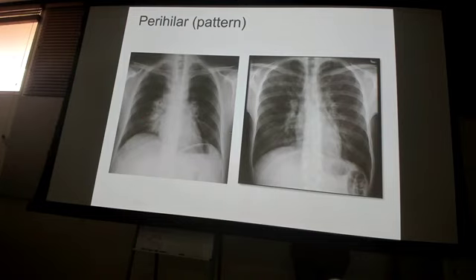So very high to the right, we're seeing all this right here. What could this be? Okay. Aspiration pneumonia, you typically see it in the upper lobes, but you could see that there. It could be just incidental findings. It could be some type of inflammatory process. It could be an infection.